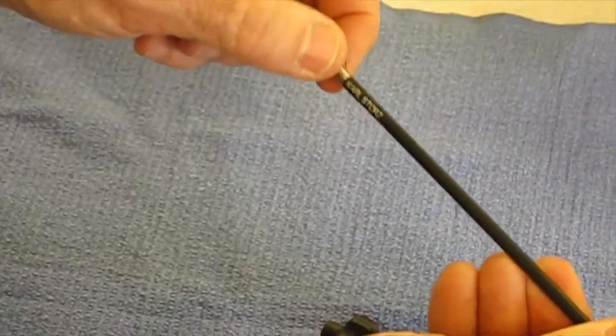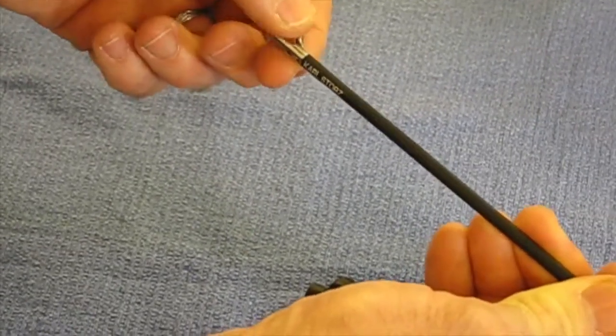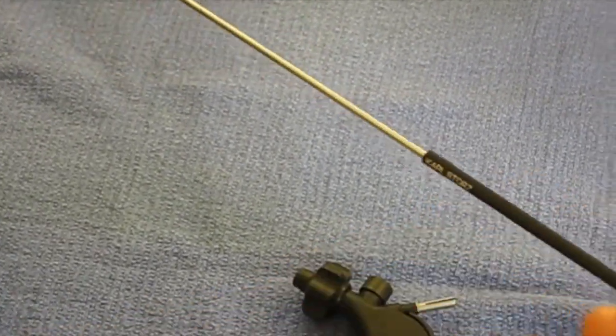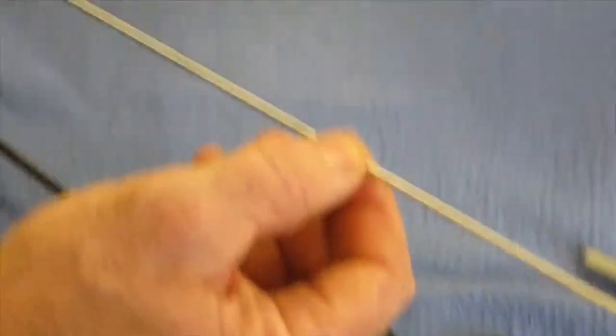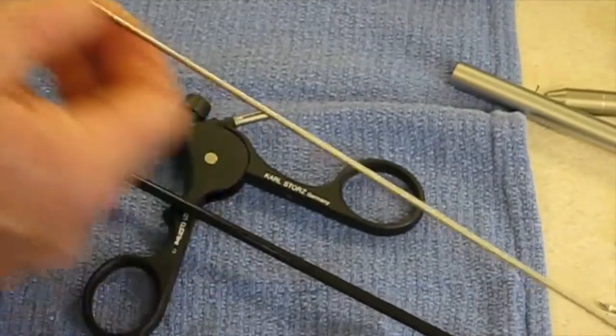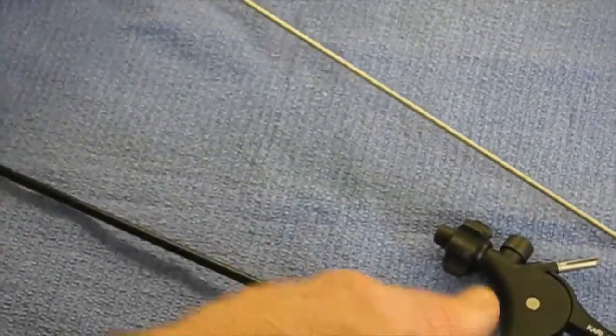The next part is to take the jaws of the instrument, rotate them clockwise or counterclockwise a quarter turn, pull out the centerpiece, the insert, and this also can soak in the enzymatic cleaner. And you want to just let it sit in there for about 10 minutes to get rid of any organic matter.